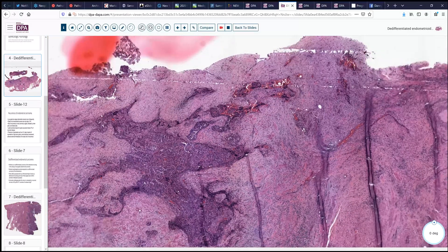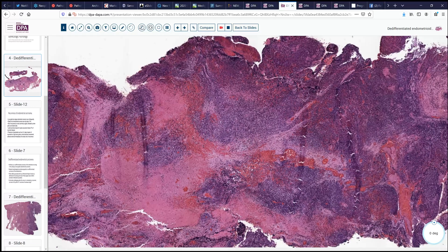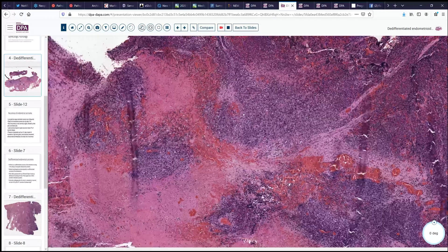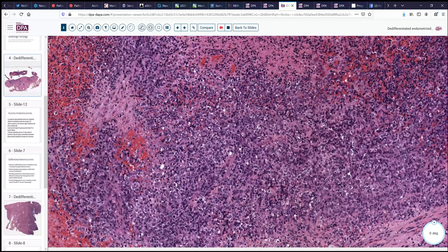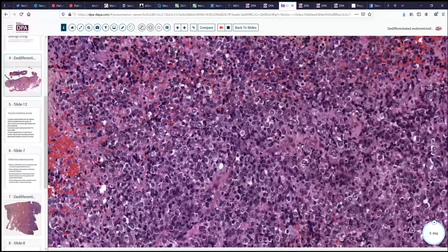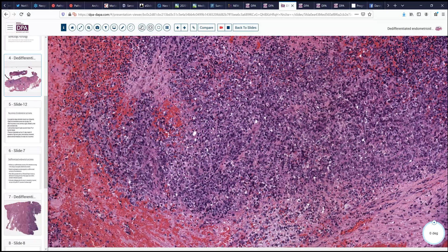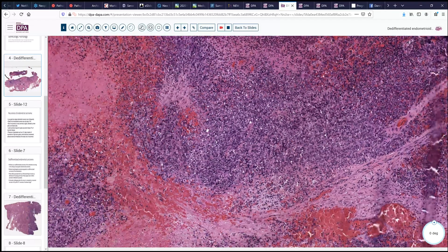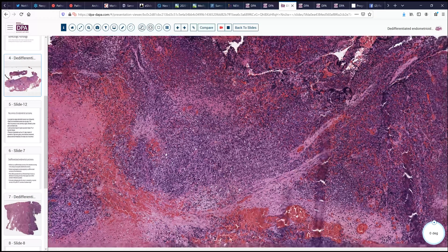But the story doesn't stop there. Looking at the rest of the tumor, which is not so attached, we see a slightly different story. It's very hemorrhagic and necrotic, and there's not that fibromuscular tissue in the background. In a well-fixed area, we don't see anything like those glands from the invasive component. This is just wall-to-wall, side-by-side malignant cells with a bit of cytoplasm, very high grade, very high mitotic rate, and some areas of necrosis and pleomorphism — essentially an undifferentiated malignant tumor. In the presence of the glandular component seen elsewhere, we would assume this is an area of de-differentiation.